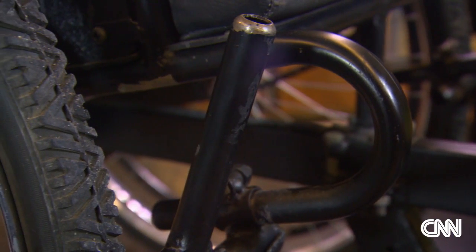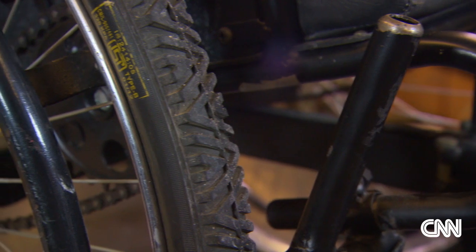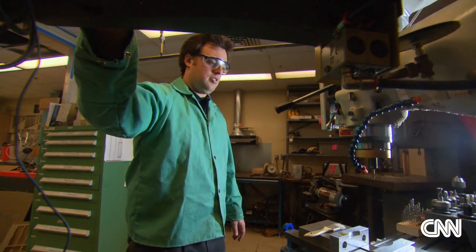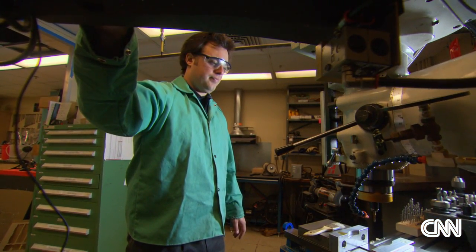Yes, it is a wheelchair. But to people with disabilities in the developing world, it is much more than that. It is a pathway to making a living, it is freedom, and according to its designer, it fills a huge need in the developing world.